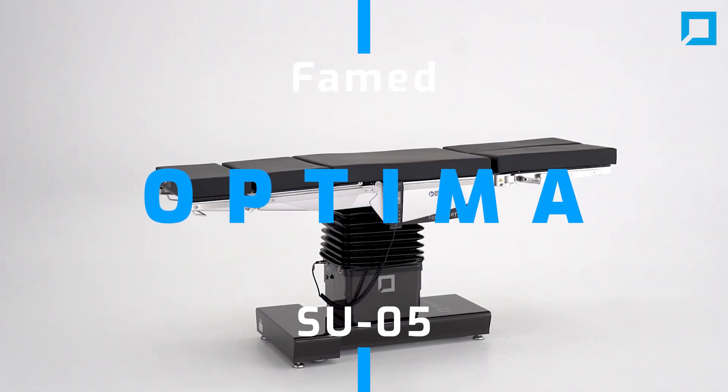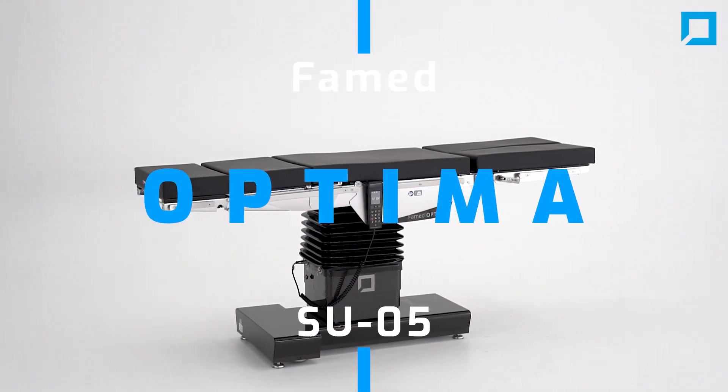Famed Optima operating table. A versatile operating table designed for precise surgery.